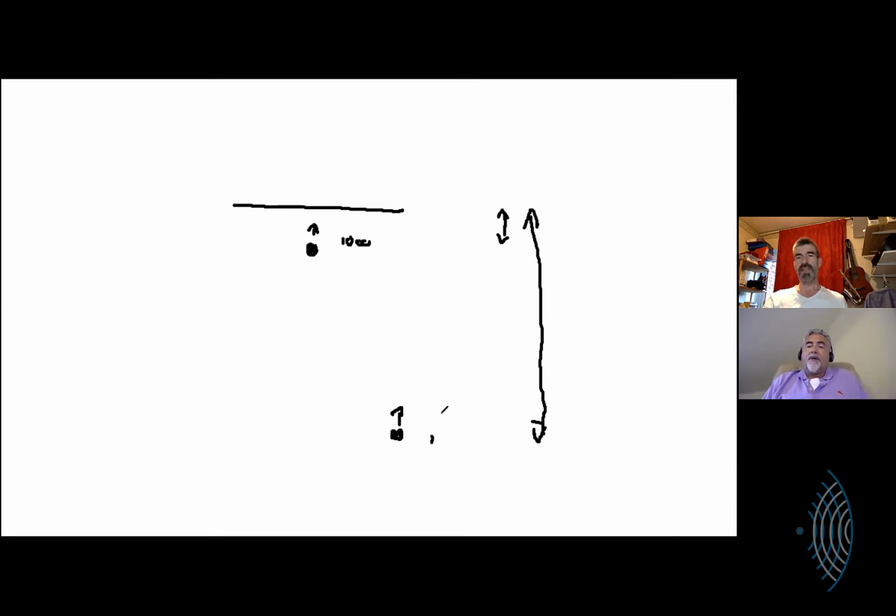Yeah, so it is just magnification. It is just an amplification. So it amplifies the signals in a sort of progressive manner. The first signals are not amplified, and then the longer the signal takes to get back, which relates to how far it is in the tissue, the more it's amplified.